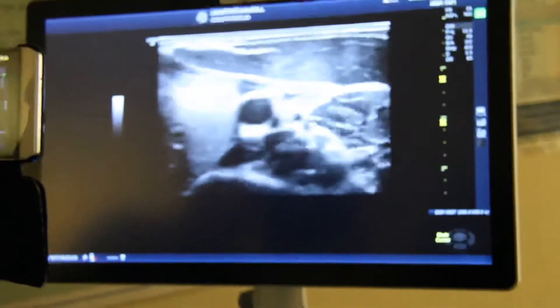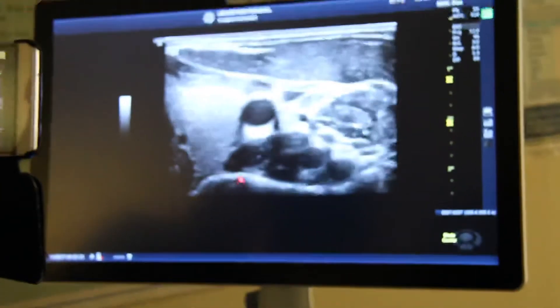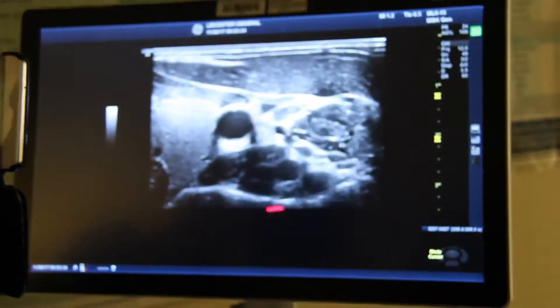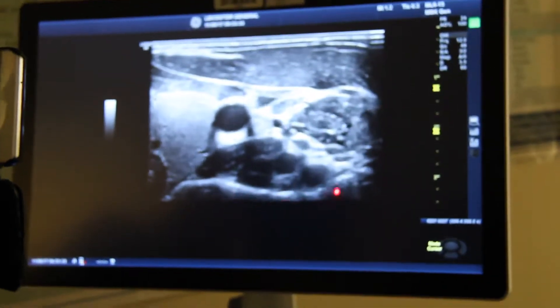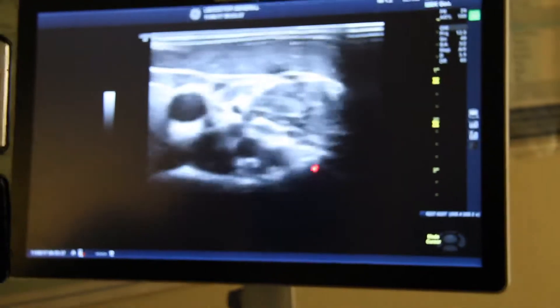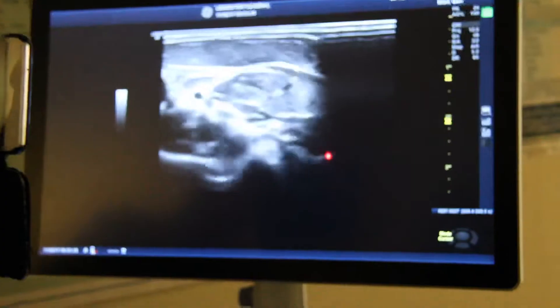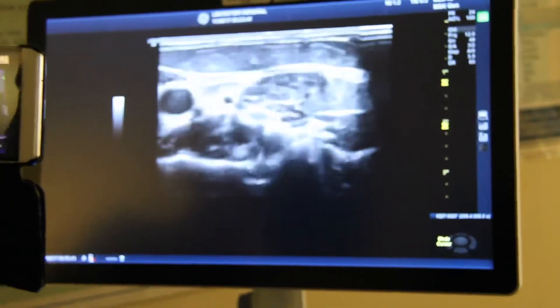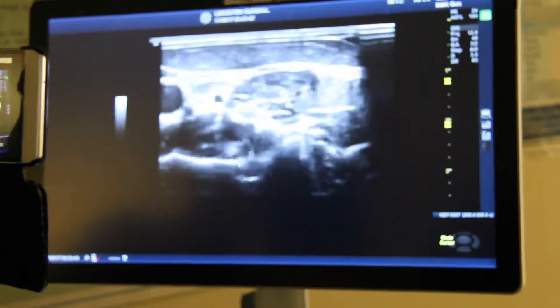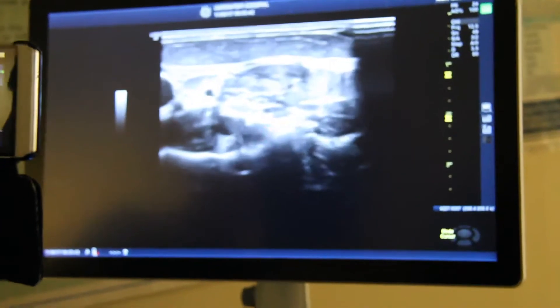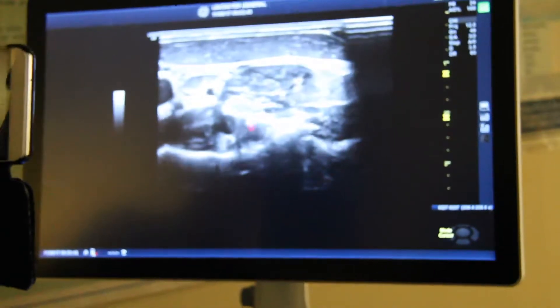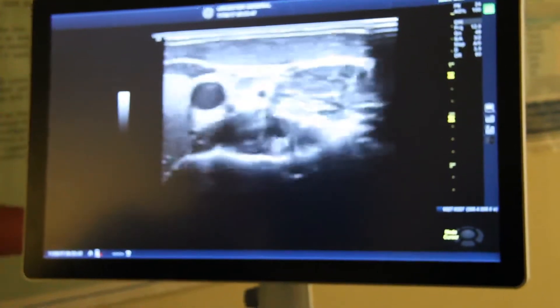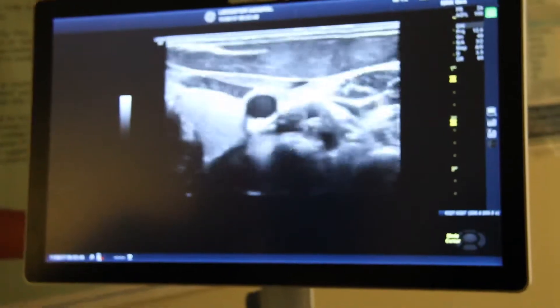If I move more laterally, I'm collapsing the internal jugular vein. At that point I start to look at the bottom of the screen — that's actually my transverse process. At this level I don't see the anterior tubercle, so this is actually at the C7 level. I have the vertebral artery pulsating along with the C7 nerve root.